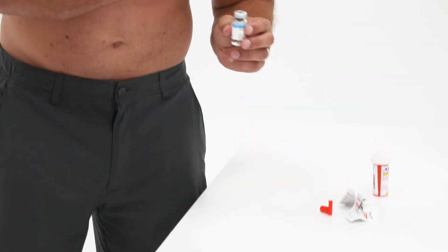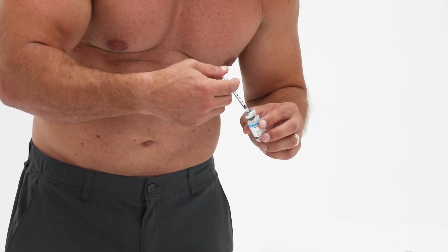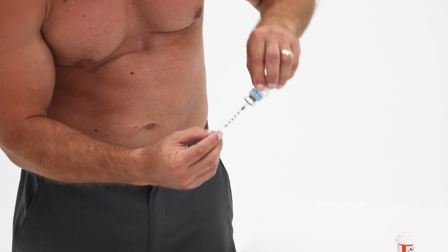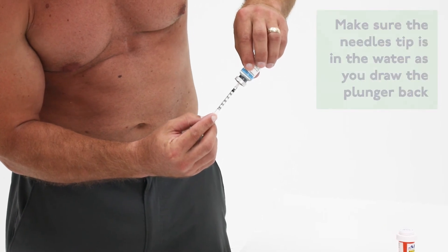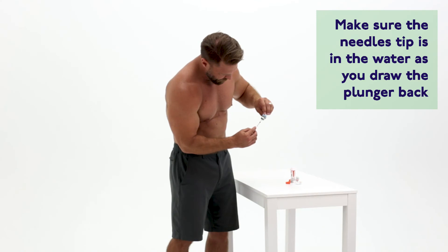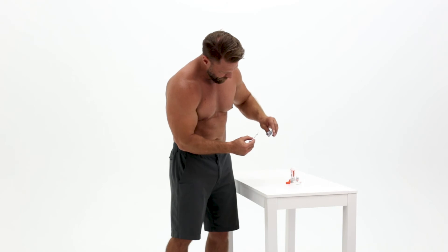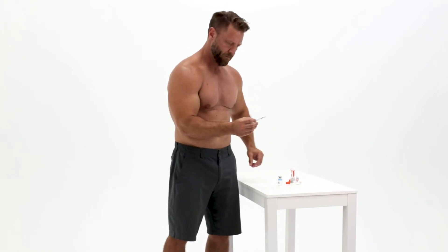Hold the barrel of the syringe as you insert the needle through the rubber stopper of the peptide vial. Once the needle is inside, flip the vial upside down and push the plunger all the way to transfer the air from the syringe into the peptide vial. Then you will pull back the plunger to transfer the prescribed amount of peptide solution into the syringe.